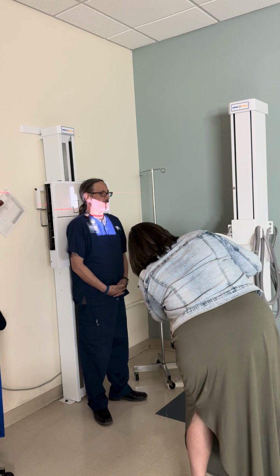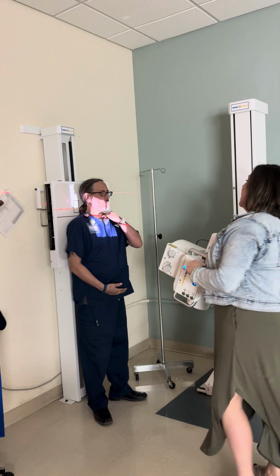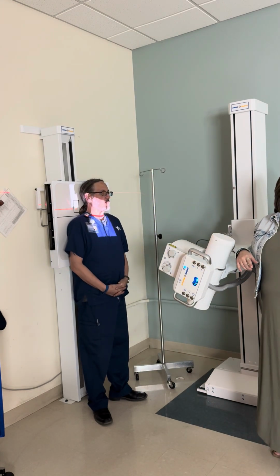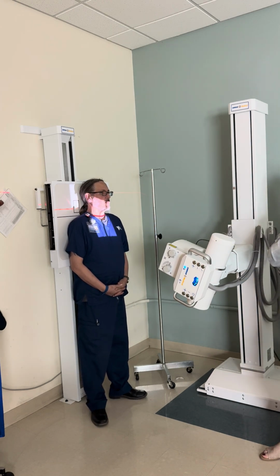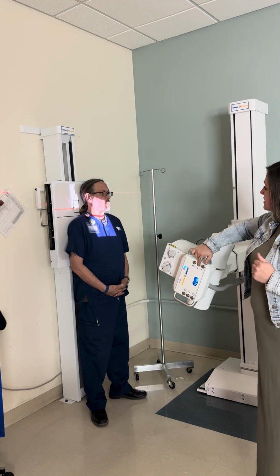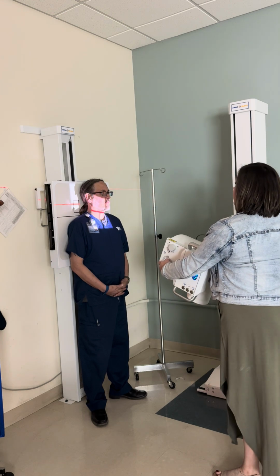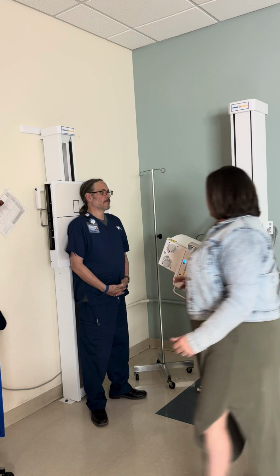For the practicum, we want to make sure that we have our patient take off any jewelry. You're fine right now. Any jewelry, glasses, anything like that. If they have a collared shirt on, we would have them take that off as well. And then for this though, we're going to center at the level of C4. We know that C4 is about the top of the thyroid cartilage, so the top of the Adam's apple.